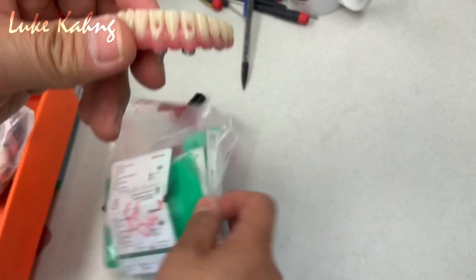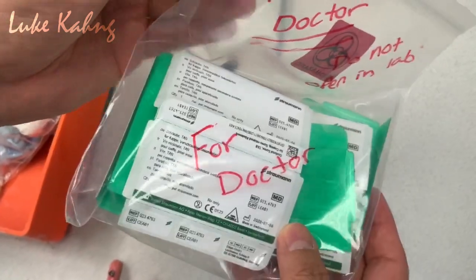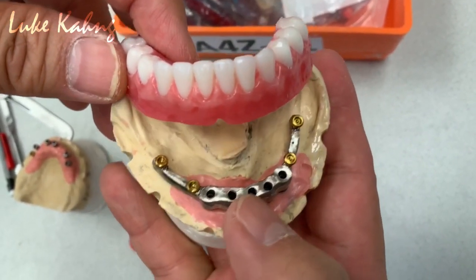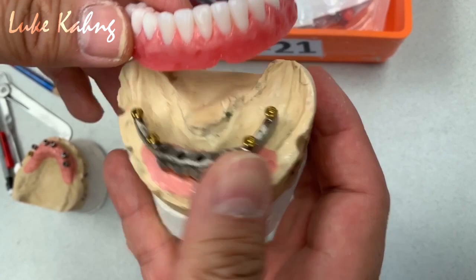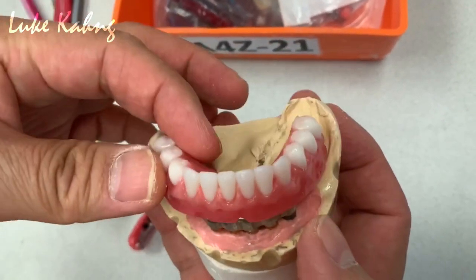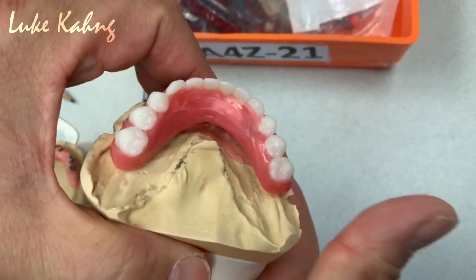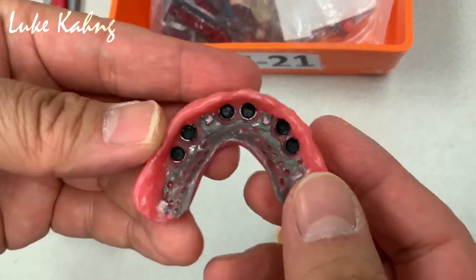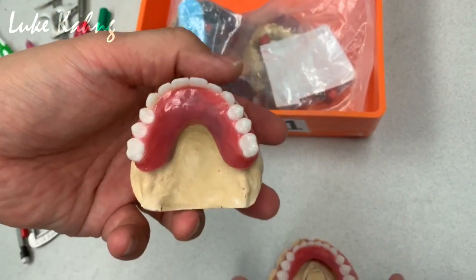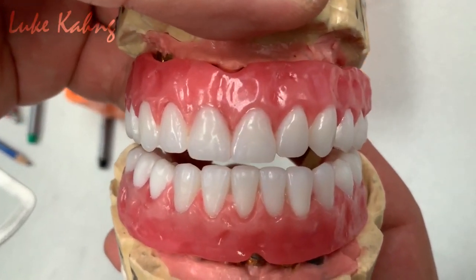All right, and then this is all strong and expensive screw for him. Okay, great. And now it's all handmade. This is the UCLA type, and then we order the locator. The welder works really well, okay. And then we make the housing, and after that we can make the mesh if they want it, and then I will send it out to try it. Okay, it's a long journey, and then upper, made the mesh with the housing. This is coming up for him. So now we send it out to wax try-in for a big case, send it to California.